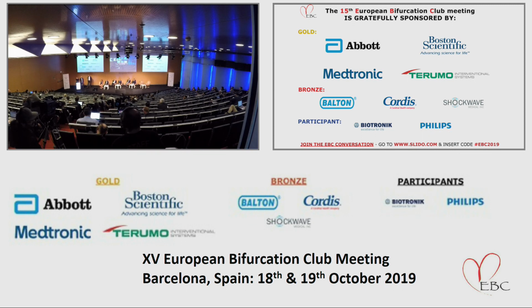So I think there has to be a caution, and we just have to remember with every technique that there will be a potential pitfall. For me, I use both, but my most compelling reason for using DK crush would be a fear of losing one or other of the branches and it offering a security. And so it would only be in a select cohort that I would use that, where Culotte would be preferred in the majority.